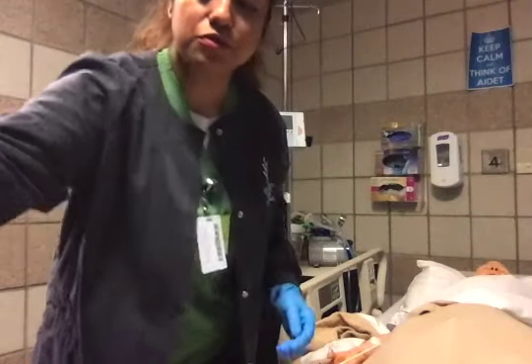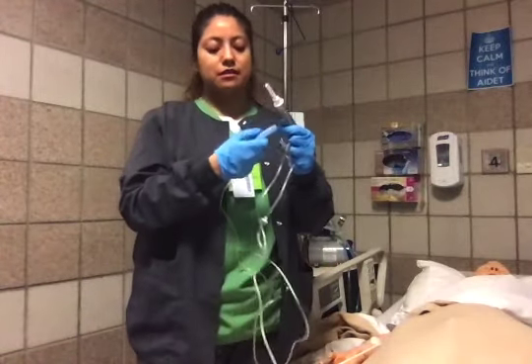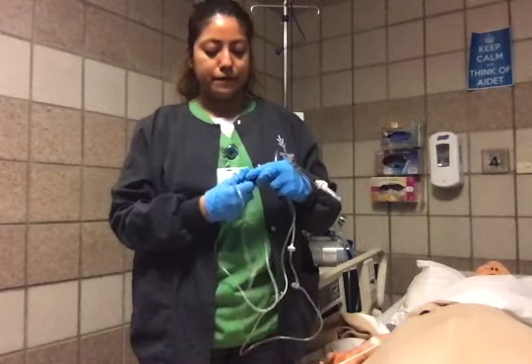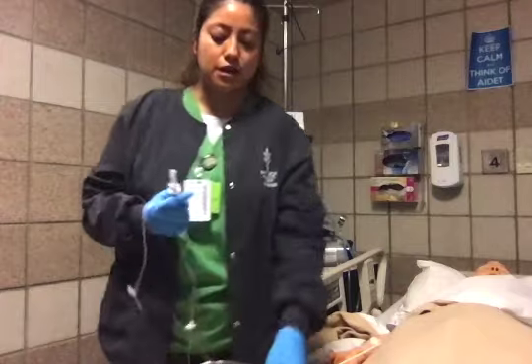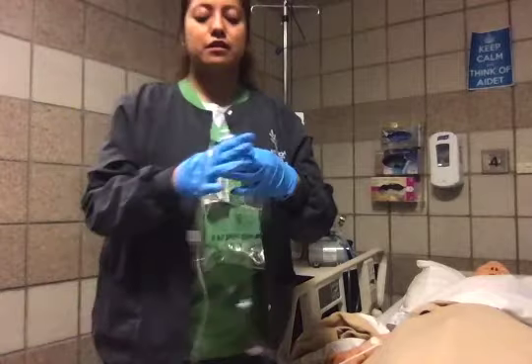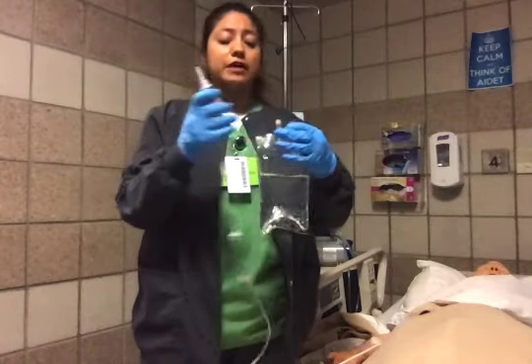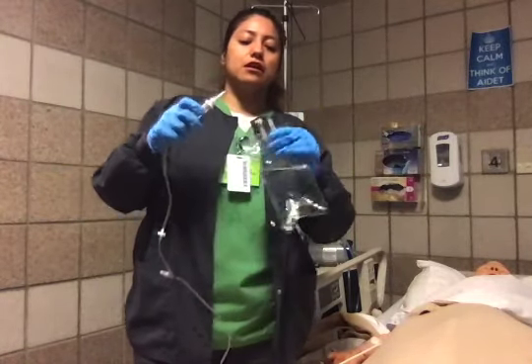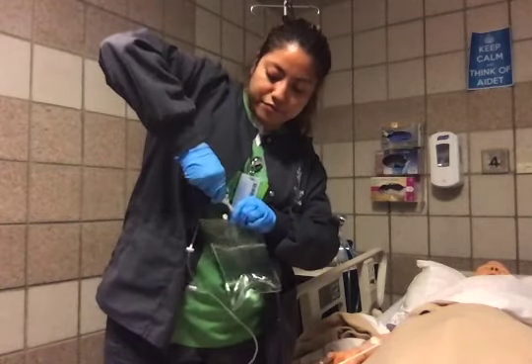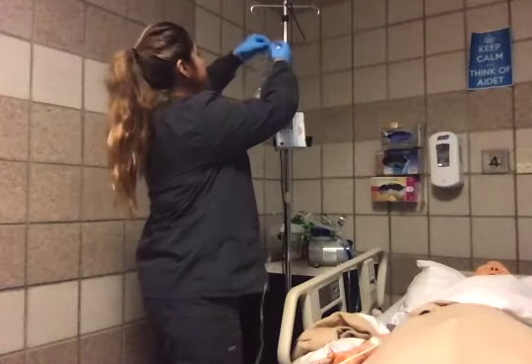I'm going to grab my primary tubing, making sure that it is unclamped, and I'm going to clamp it. Okay, and now, not contaminating either end, I'm going to take off the lids, not touching or contaminating the spike. And with one firm push and twisting motion, I'm going to spike my bag. Okay, so it's spiked. And then I will hang this up here.